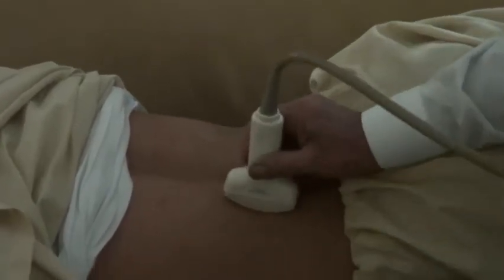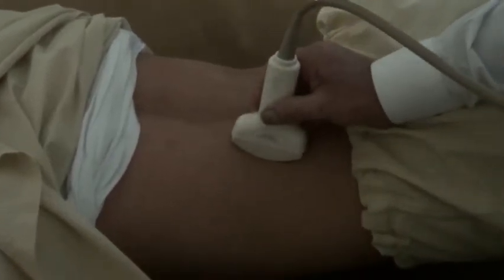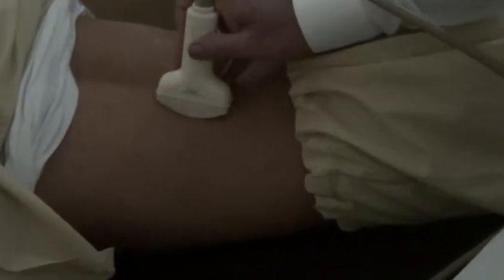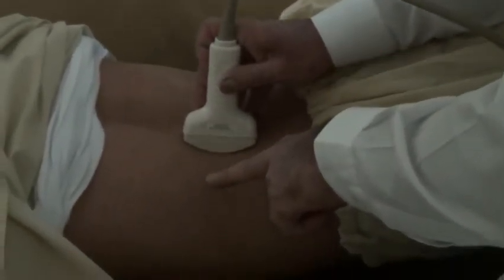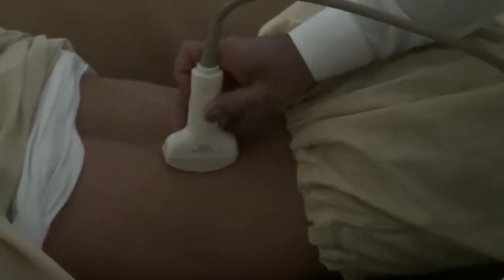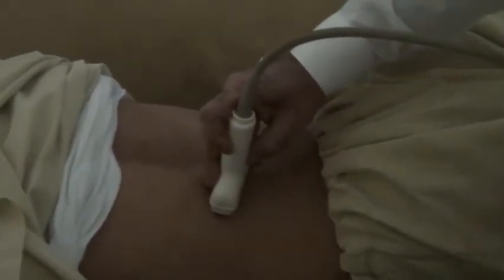In case of this side, left side, again, this is the vertebral column. There is the probe with a bit of angling. Move upwards, and again you angle the probe laterally to get the kidney in total, and then give the probe a 90-degree sweep from where you are getting the kidney in total. So now let's see on the ultrasound.